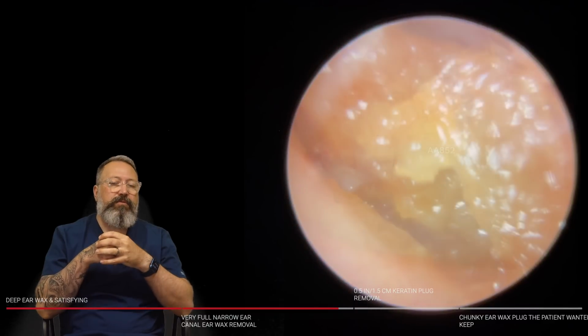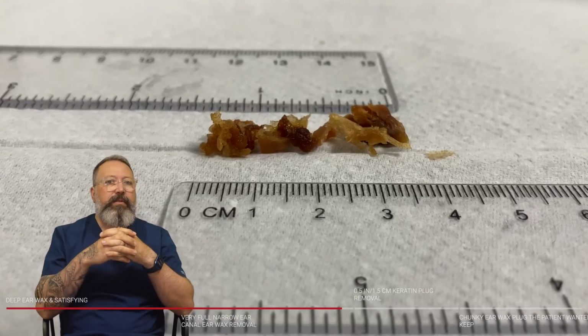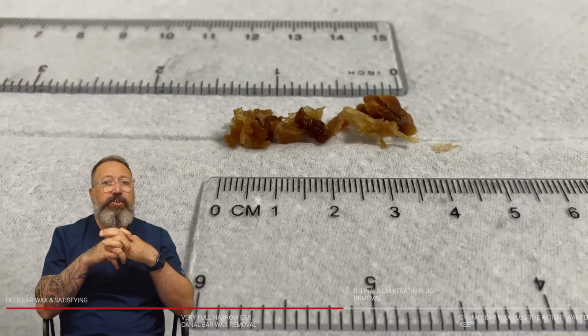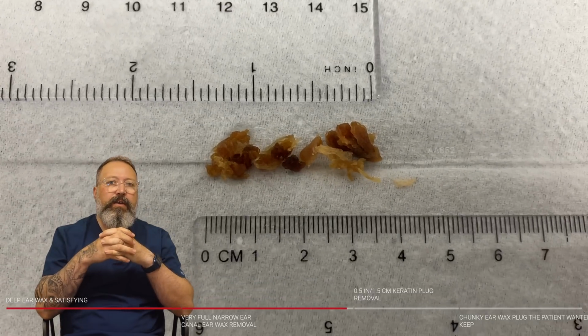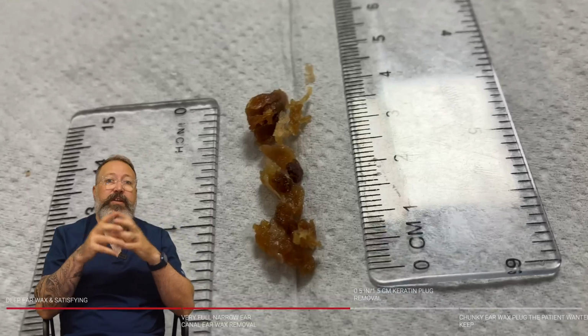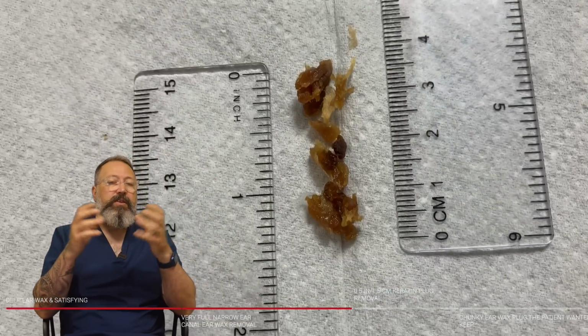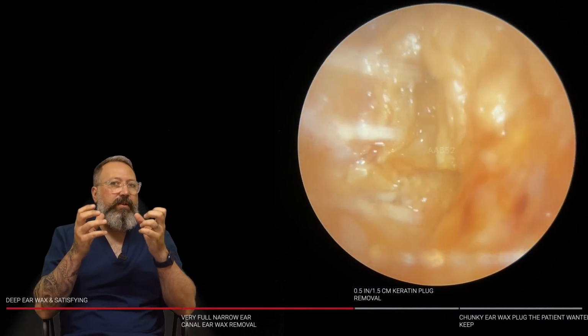Now, a bit of tympanosclerosis there as well. This was an elderly lady. We expect to see it. But this is what we removed, 3.5 centimeters, just under 1.5 inches worth of earwax there, guys, for you. So it's all looking very good. Lots of different colors in there as well, different gradations of lighter and darker colors. Remember I said there was that keratin ribbon, so there'd be some dry skin. Usually makes it look a little bit lighter.